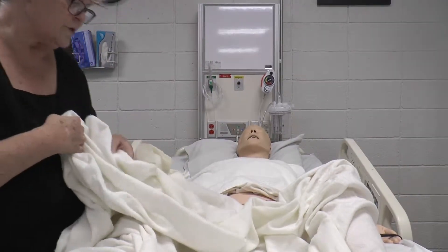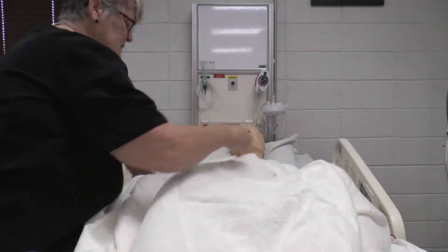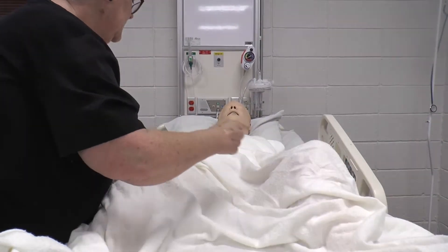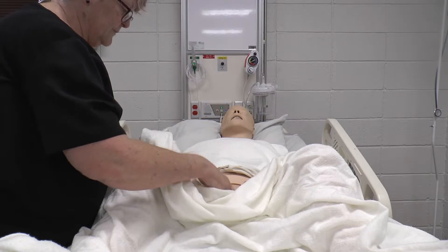Hi Mr. Smith, my name is Ann, I'm your student nurse today. I'm going to put a tube up to your bladder to get a UA — it's not going to stay, it will come back out. Have you ever had one before? He says yes. Cover him up with the bath blanket like so, covering his feet.